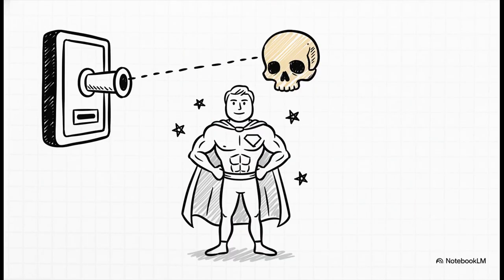Okay, let's dive into this, because your plan B is the Haas method. The Haas method is honestly the hero for this exact patient scenario. It's a PA axial skull projection that shows the exact same anatomical structures as the Towne method, specifically targeting that occipital bone you're after, but it approaches the skull from the completely opposite direction. It's just a fantastic real-world workaround for those hypersthenic patients.